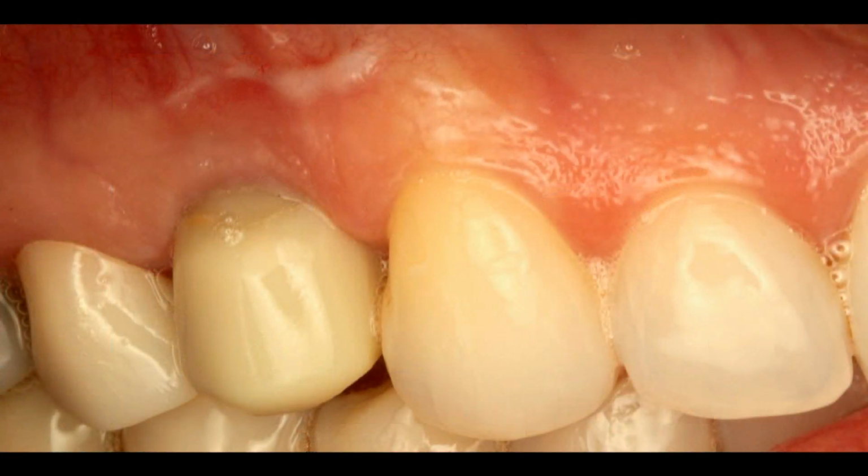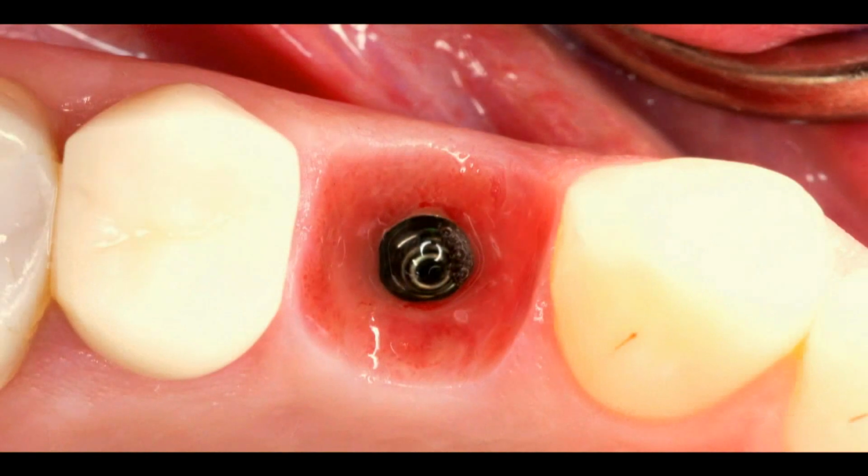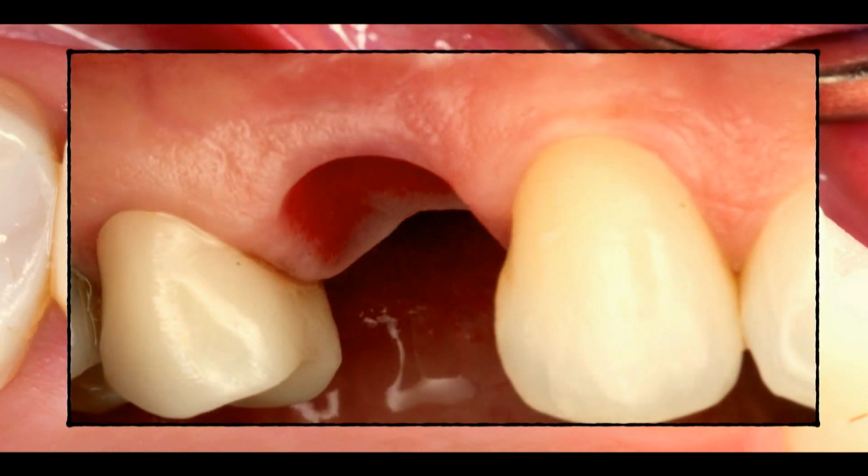I just had her come back this week so I could take off the temp and take impressions. And you can see beautiful soft tissue healing. We have that beautiful contour restored. From the buccal side, you can see some papilla now. So we're going to be in really good shape.